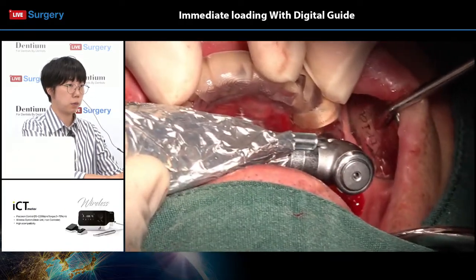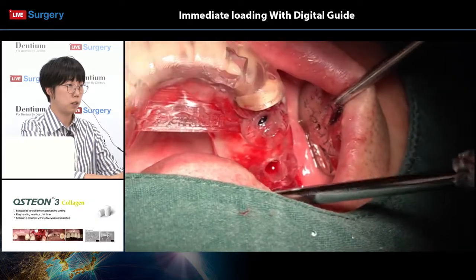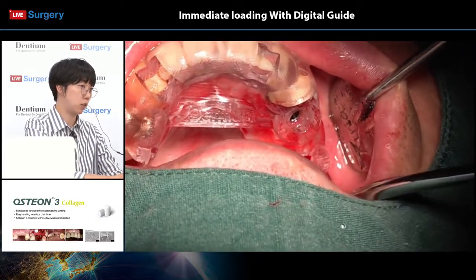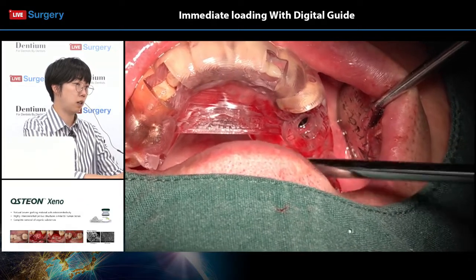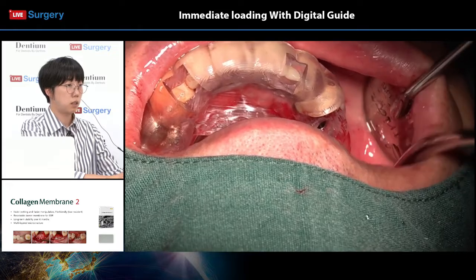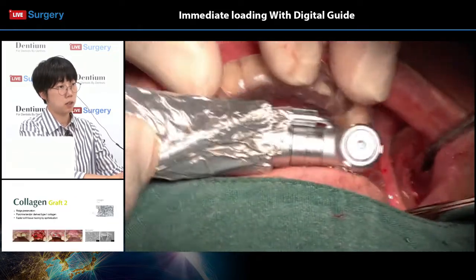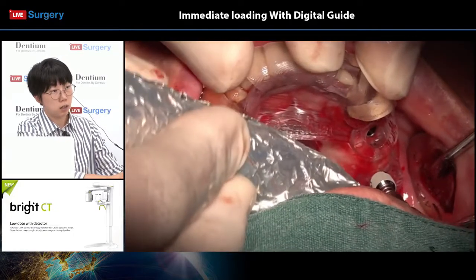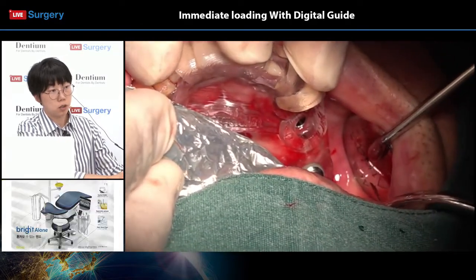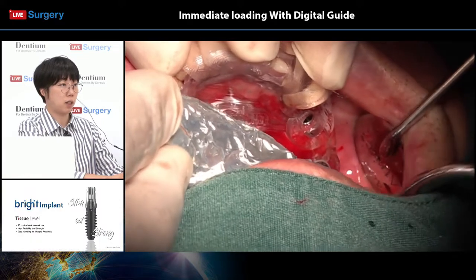Dr. Lee is now positioning the implant for tooth number 24 area. I believe he has slightly underdrilled the area to maximize initial stability. The implant positioned here is a supraline implant, the same implant that was positioned on the right side, and the diameter is 4.5 with length 10.